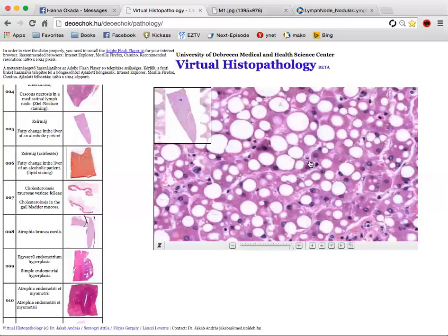This is a part of the reversible cell damage. And this is an alcoholic, so they're not really feeding themselves right, and there's a lot of enzymatic digestion of the alcohol. And this is where it leads to.